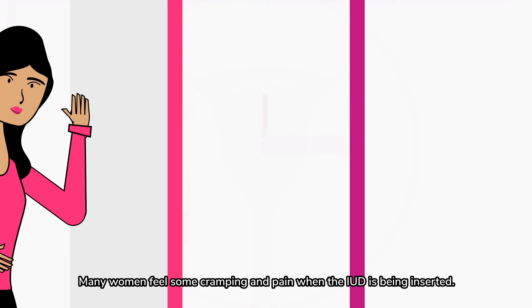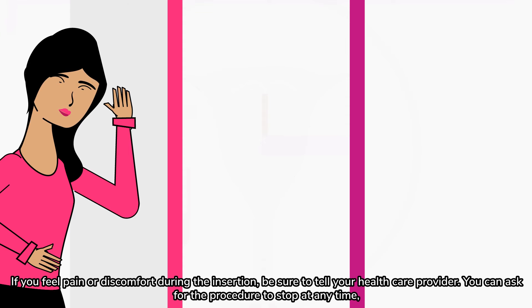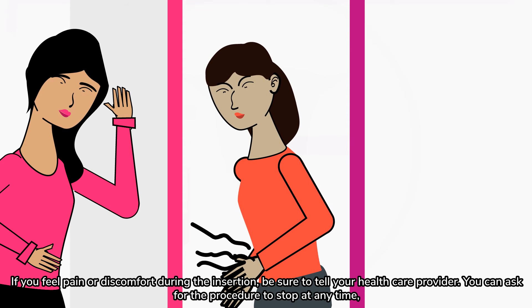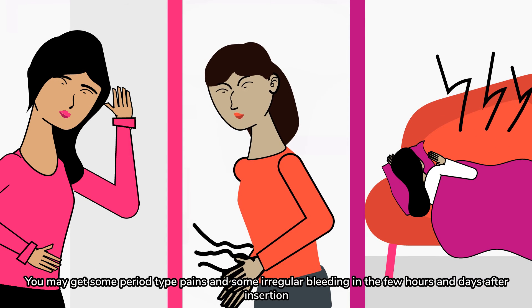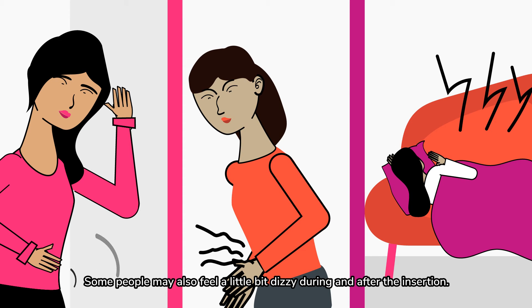Many women feel some cramping and pain when the IUD is being inserted. If you feel pain or discomfort during the insertion, be sure to tell your healthcare provider — you can ask for the procedure to stop at any time. You may get some period-type pains and some irregular bleeding in the few hours and days after insertion. Some people may also feel a little dizzy during and after the insertion.